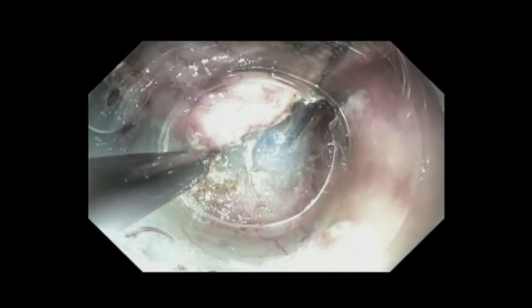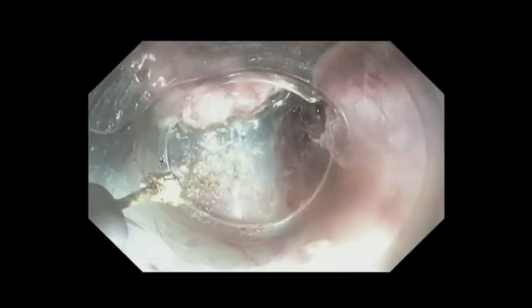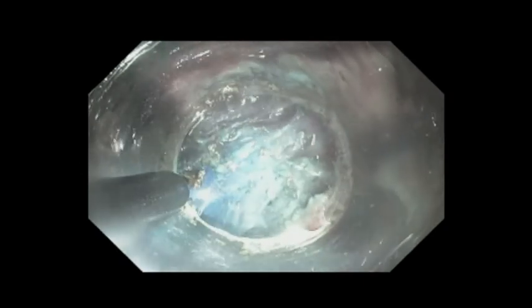We then proceeded with standard submucosal dissection using a TT knife — a triangle tip knife — with cautery. The submucosal layer is very easily seen when injected with the blue dye. We added a plastic dissection cap to the endoscope, which also facilitates retraction, especially helpful in larger lesions, as it essentially creates a flap over the top of the endoscope that would otherwise obscure your view and the retraction system.